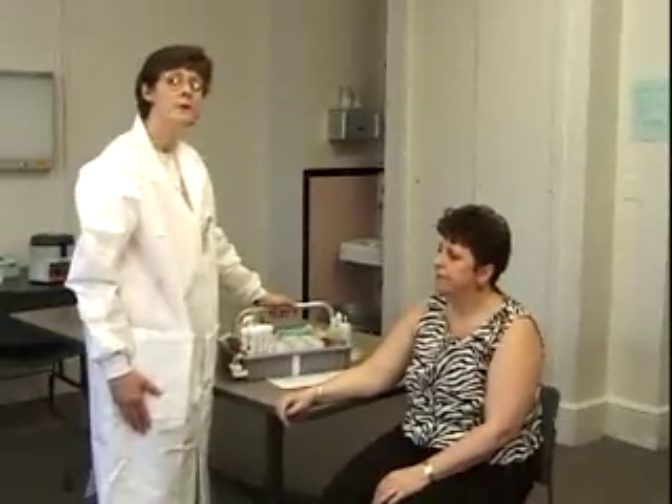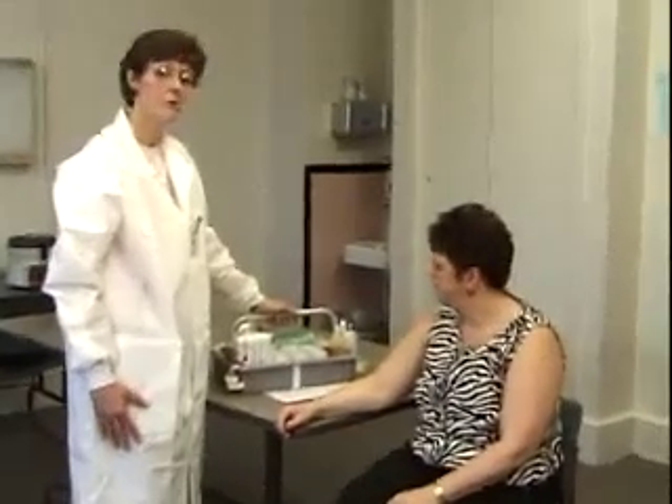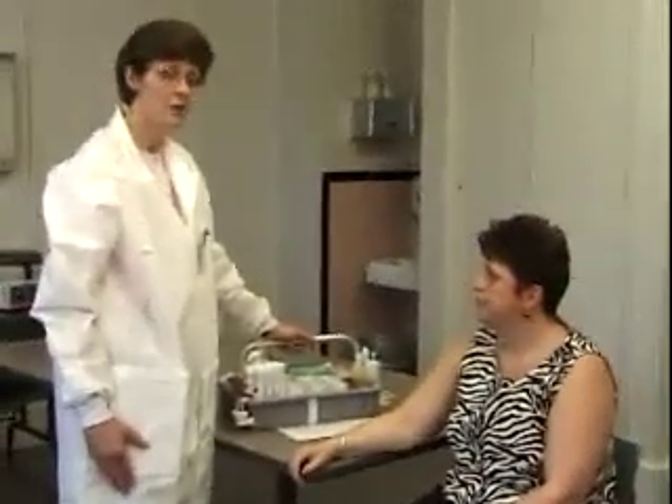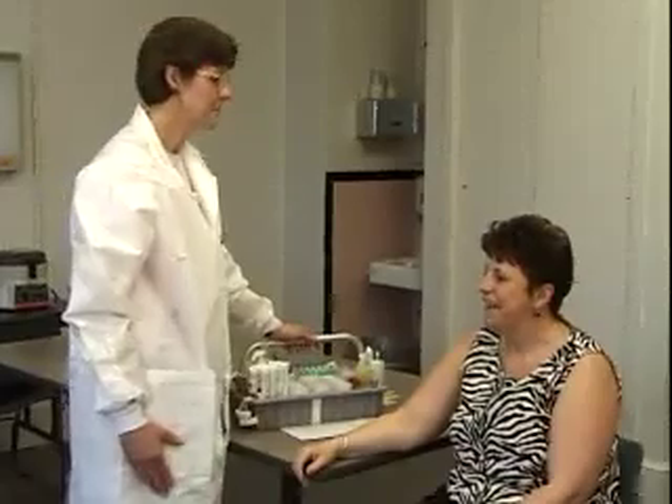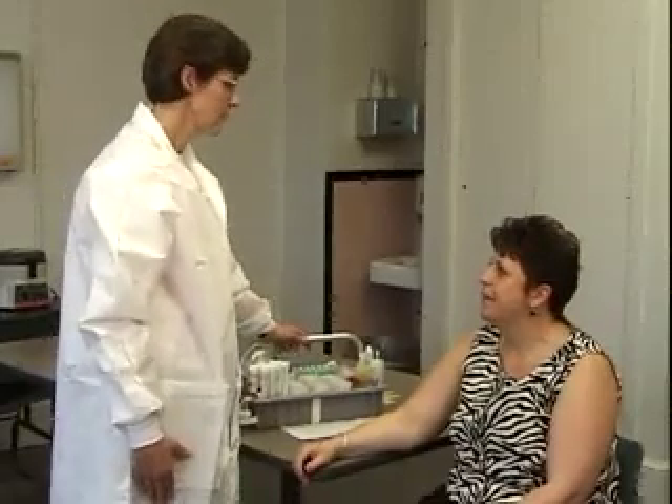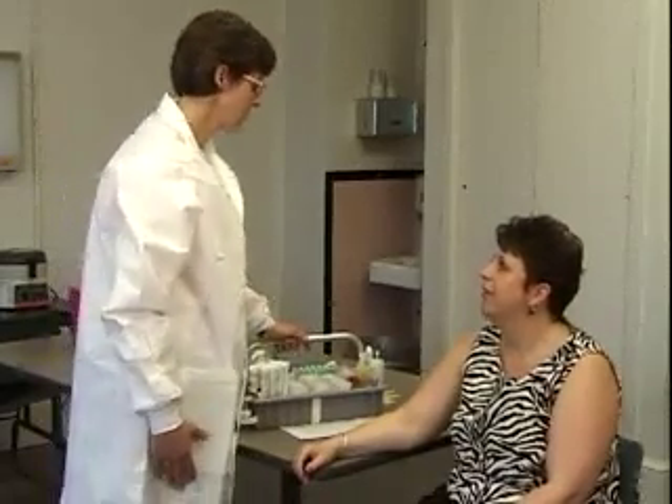The first thing you want to do is make sure that you have the correct patient. In our outpatient area we ask the patient to state their name and date of birth. Ma'am, what is your name? My name is Alice Smith and my date of birth is July 4th, 1959.